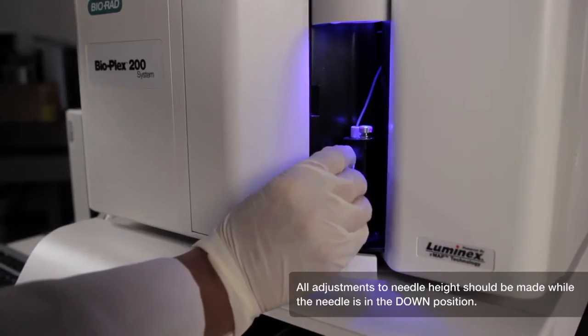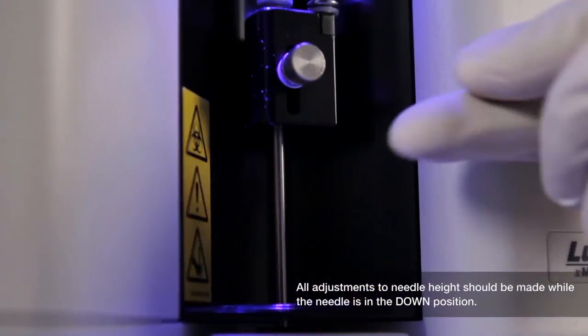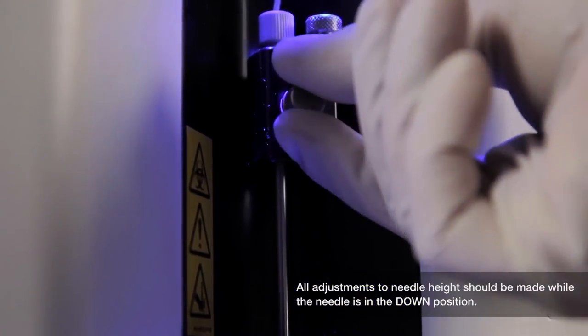With the needle in this down position, slowly loosen the needle height adjustment thumb screw so the needle housing can freely move up and down.